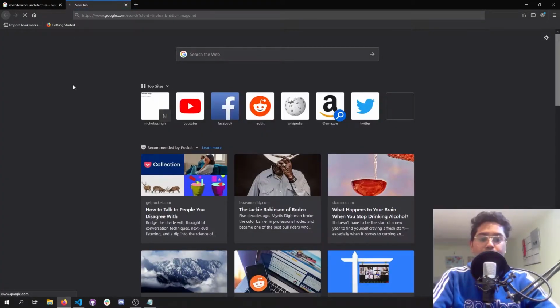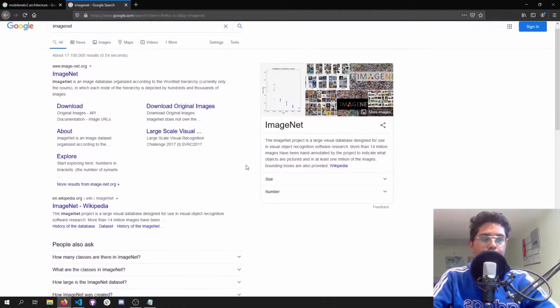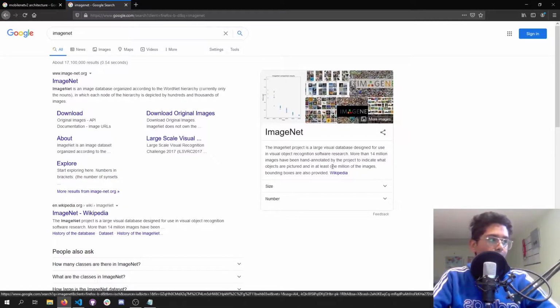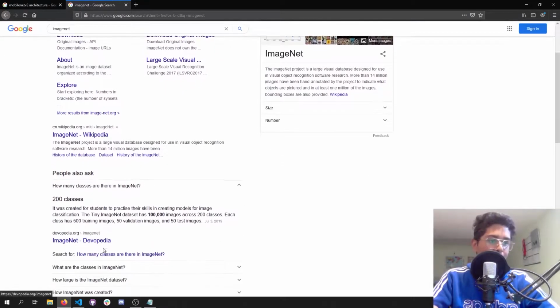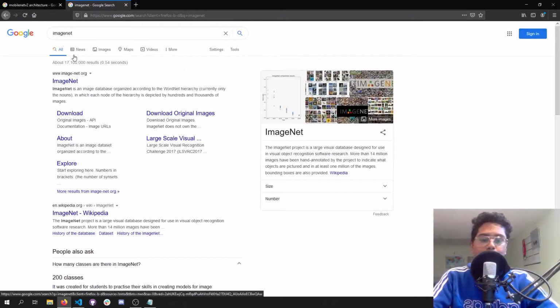ImageNet is a dataset that consists of 1,000 classes and has more than 14 million images. There are many different models that have been trained on this dataset, some of the ones known as MobileNet, for example, and ResNet. These models are pre-trained models that have achieved state-of-the-art results on predicting around 1,000 classes, which is insane. These models are very well done and they're state of the art, so we can also implement these models in our example of skin cancer detection.